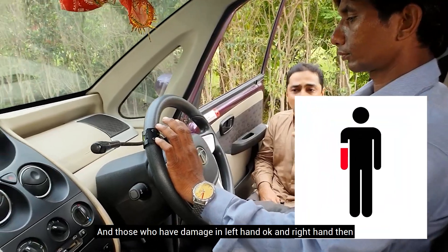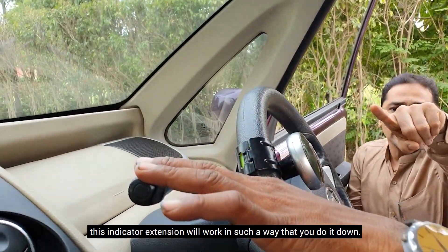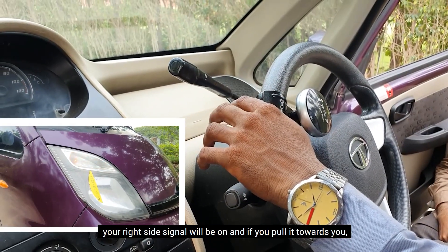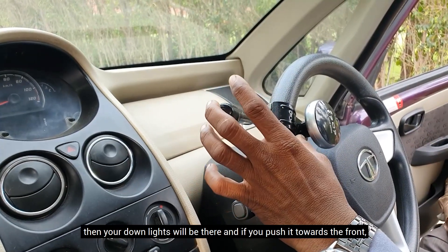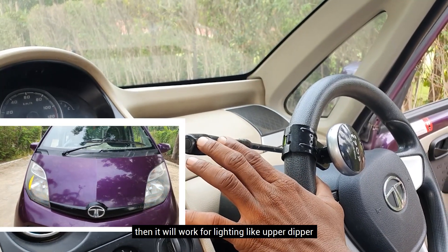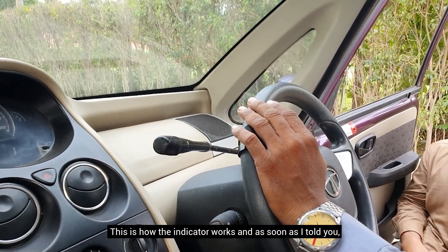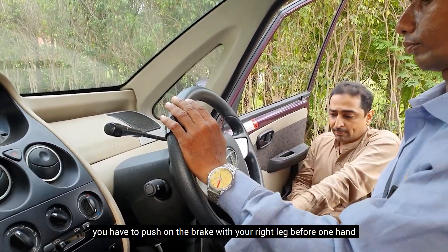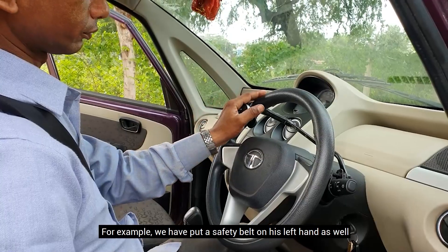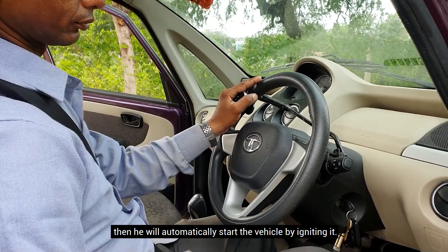The steering knob is used to control the steering wheel, and the indicator extension is connected to it. The left side signal is on the left side and the right side signal is on the right side. If you push it forward, you will get down lights. If you push it further forward, upper and dipper lighting will work. You have to push the brake with the right leg and start the car from the ignition. Then they will start the car from the ignition.